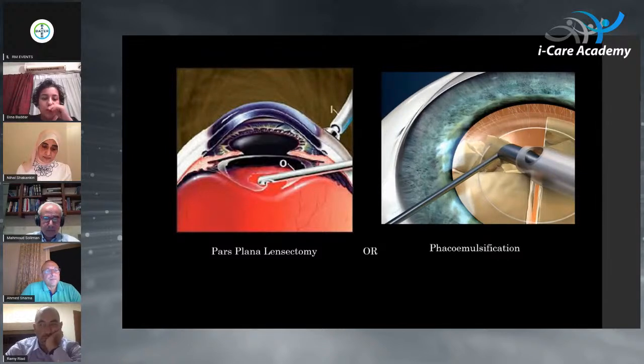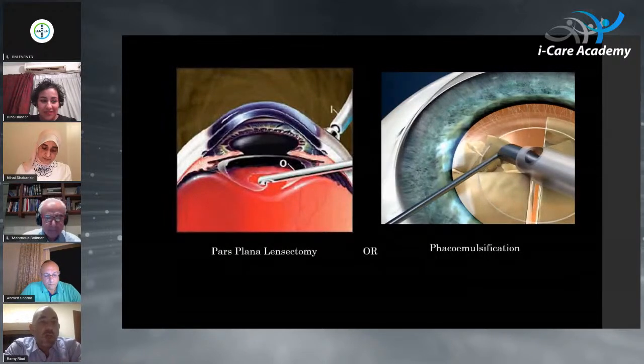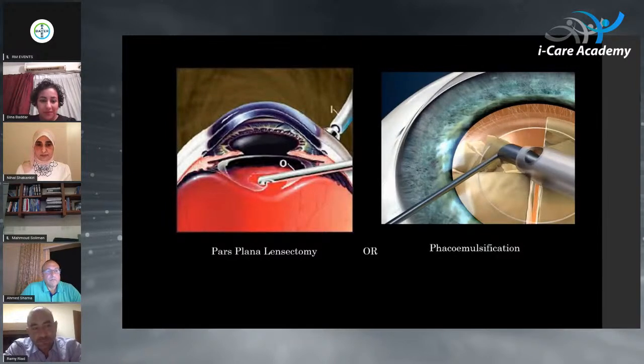Okay. Ramy, which patients would you prefer a lensectomy on and which a phaco? You know what? When I first learned congenital cataract, I learned it as lensectomy. We usually used to do lensectomies all the time, but since I started working as a consultant, I never resort to lensectomies. I always prefer to try to do a phaco with a proper anterior rhexis, posterior rhexis, and that makes it much easier for me. I don't do lensectomies anymore.